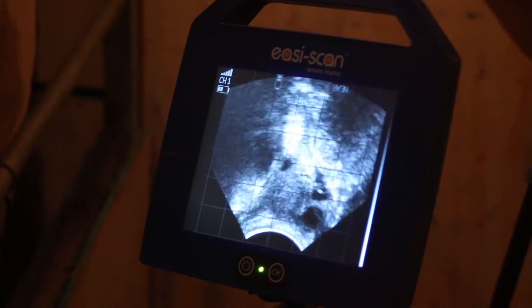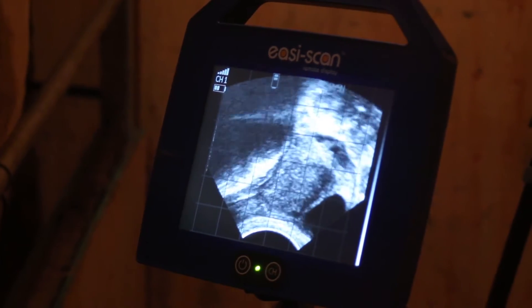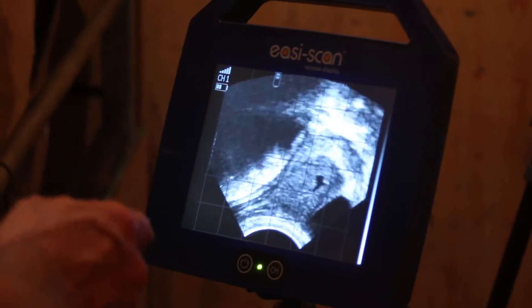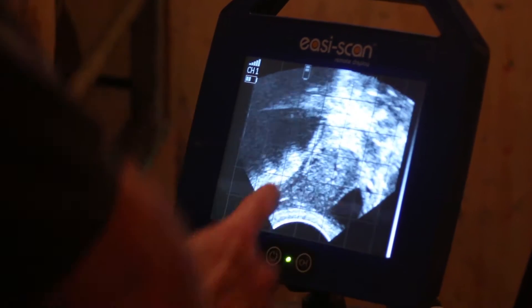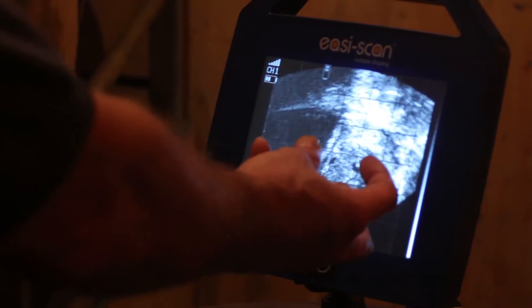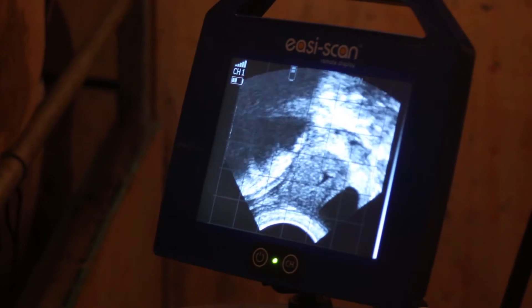I normally leave the big one to last but because it'll be good on film, I'll give you the big follicle first. I'm positioning the big follicle here just where the needle will emerge out of the probe. The needle will go straight into the middle of the follicle, suck out the follicular fluid and hopefully retrieve the oocyte that was within the follicular structure.